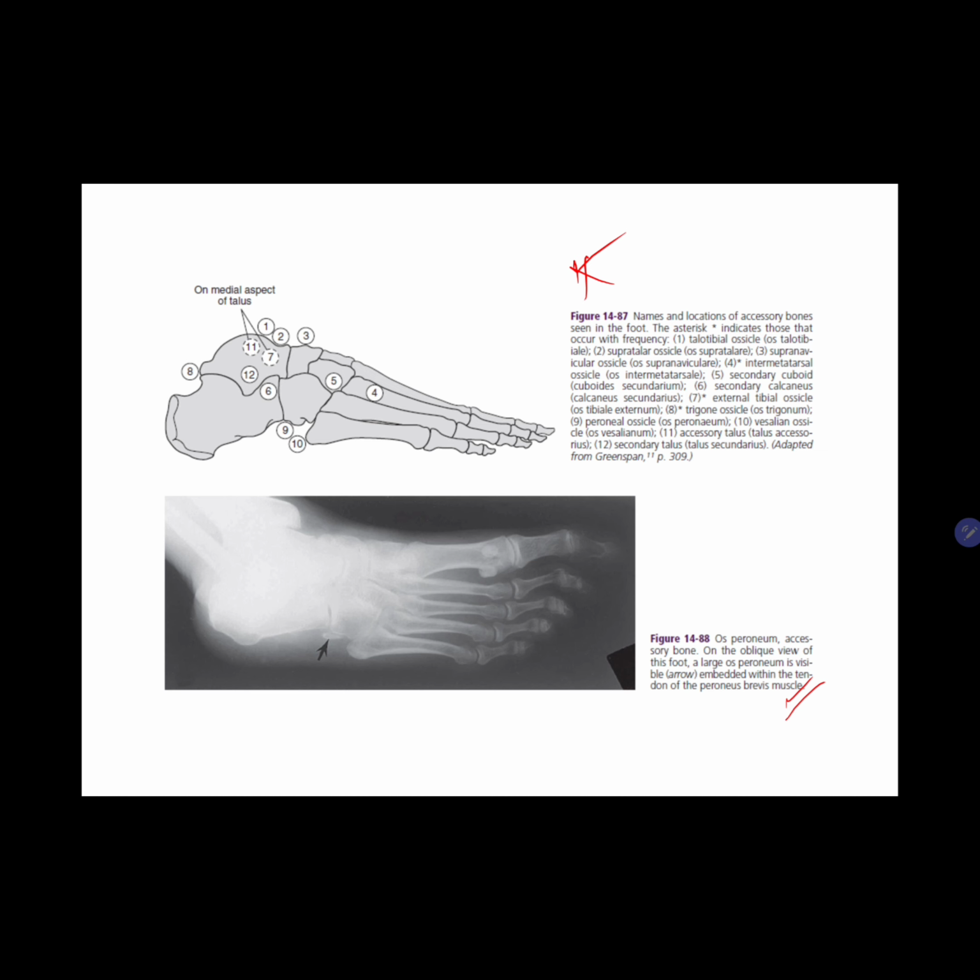Right, so I think that ends up the ankle joint or ankle and the foot. And then just a quick summary of key points. We talked about the routine radiograph evaluations of the ankle, the AP view, the AP oblique view or the mortise view, and the lateral view. We discussed the routine radiologic evaluations of the foot, specifically the AP, the lateral, and the oblique view. We had the advanced imaging, wherein the CT scan, the CT exam, and the MRI. The ABCs: alignment, bone density, cartilage, edema, and soft tissues.